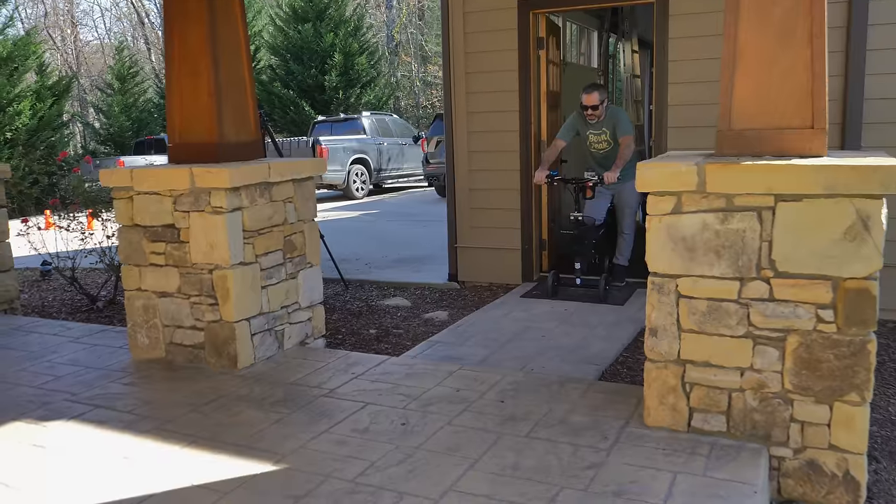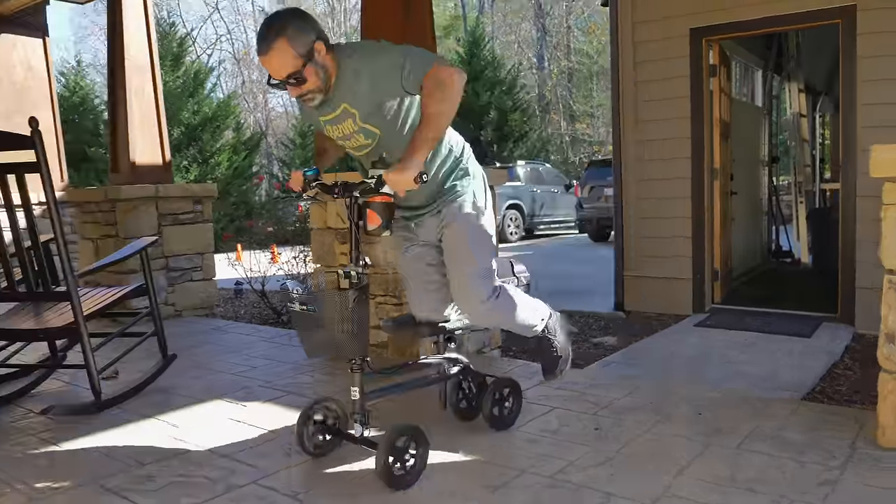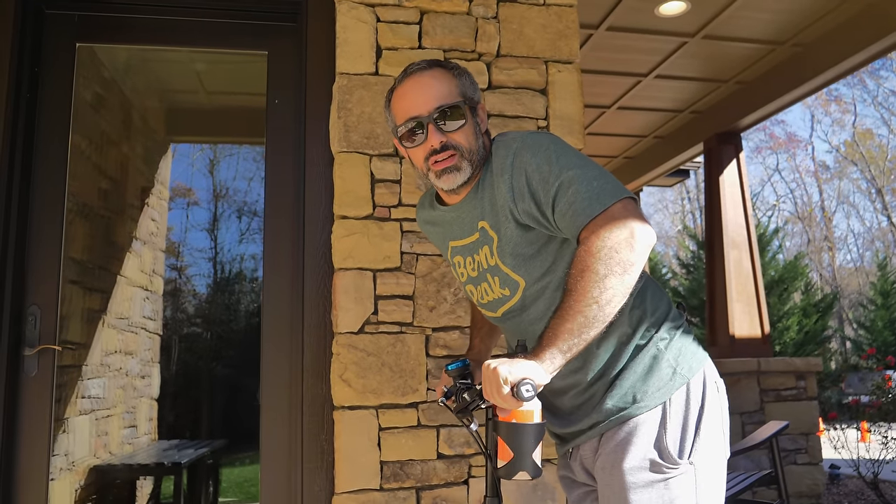So between the garage and the house is a step — I think I can fast plant it. Okay, I got to get some speed. Wasn't smooth and I'm not going to try it again.